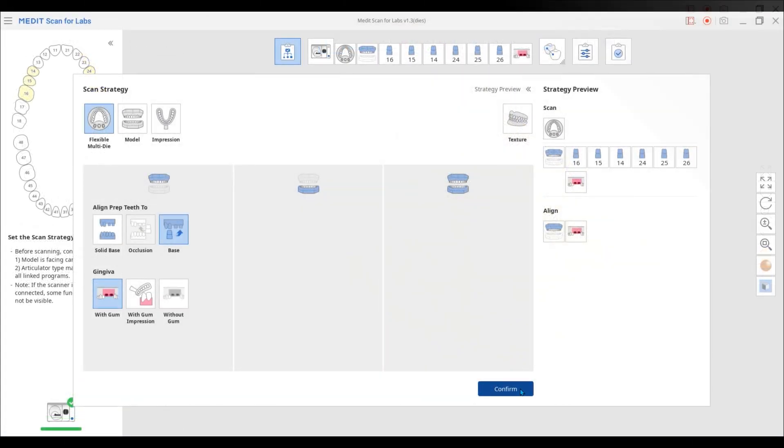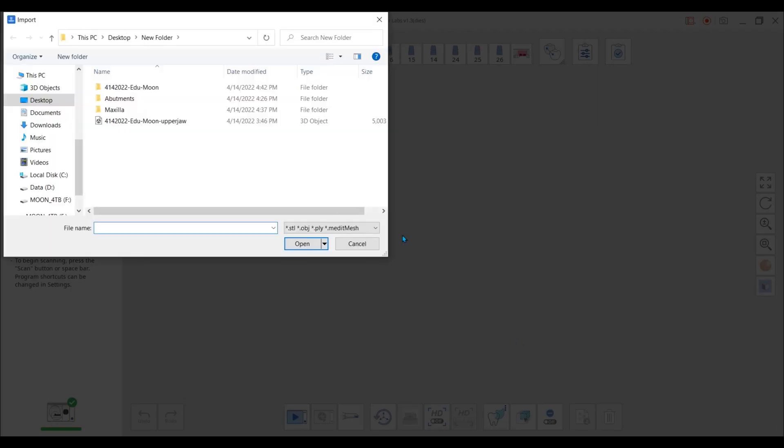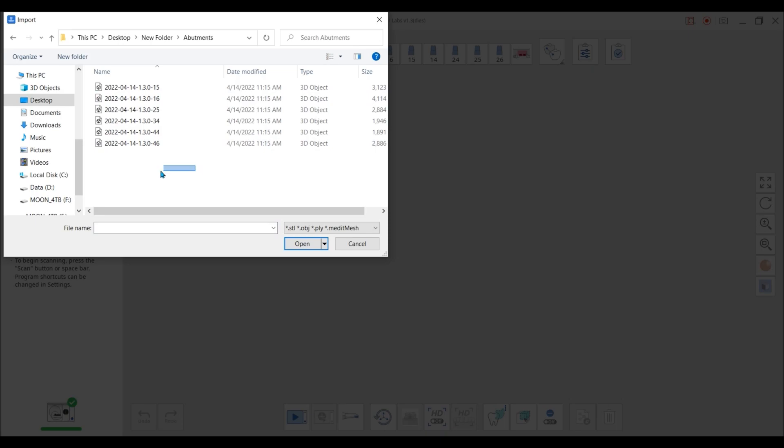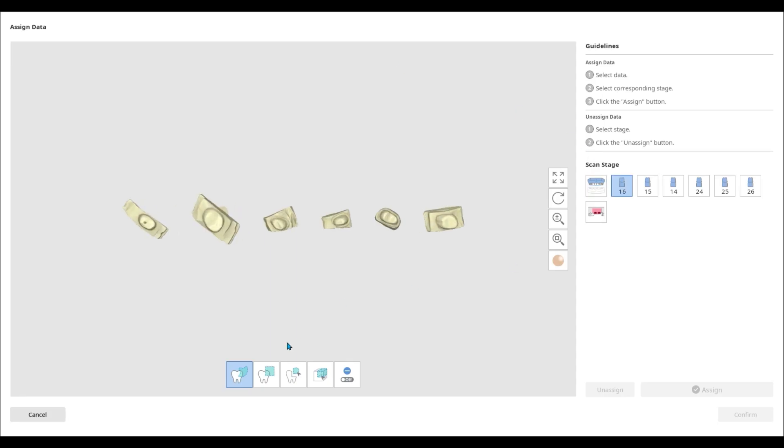In addition, if you are going to use the Flexible Multi-Die Scan Strategy, multiple 3D data can be uploaded all at once and then assigned to the respective scan stage.